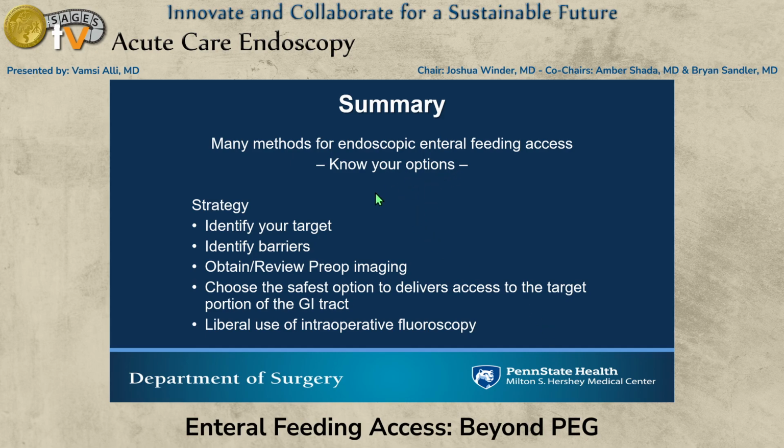Know what your options are, identify your target, identify the barriers that are in your way, obtain and review your imaging, choose the safest option to get to your target, and use liberally intraop fluoroscopy to help guide your choices.